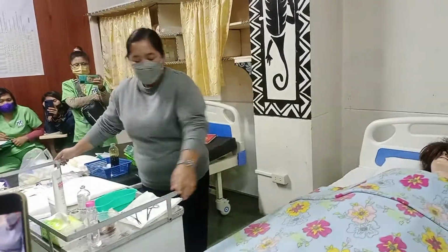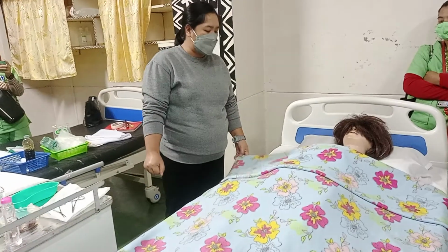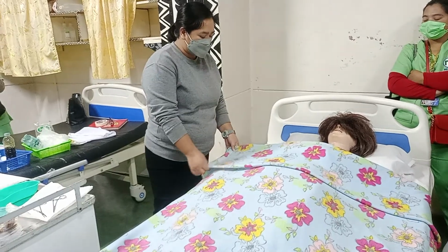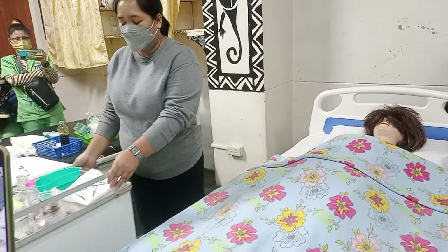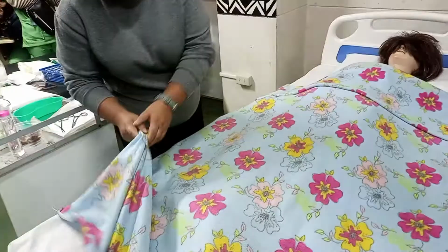So, good morning, ma'am. I am back. I'm Grace, your caregiver again, and I am back. And are you ready to proceed with the catheterization? Yes. Okay. So there you go. Thank you for allowing me. I am now going to untap the linens.